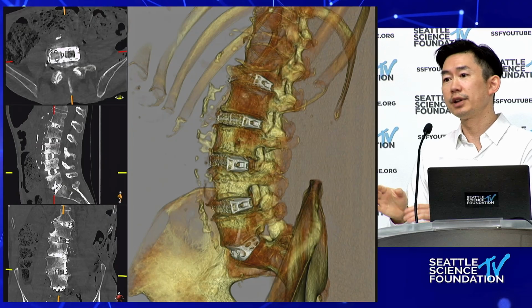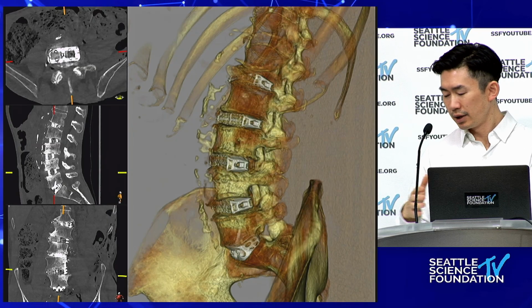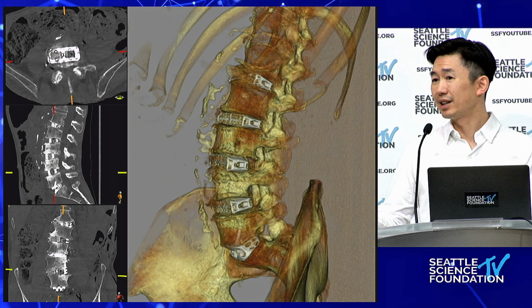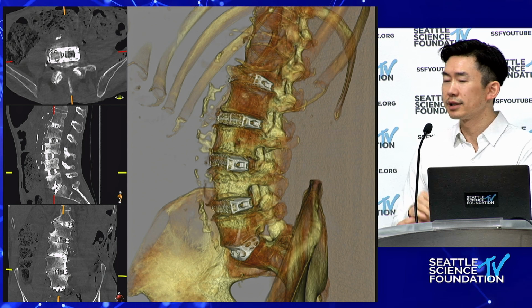So you're trialing to the larger side before you insert? Correct. Yeah, so I still trial everything. I sort of measure it, because with the cages themselves, I just look at what the trials look like to match it, and then I'll trial it to that.